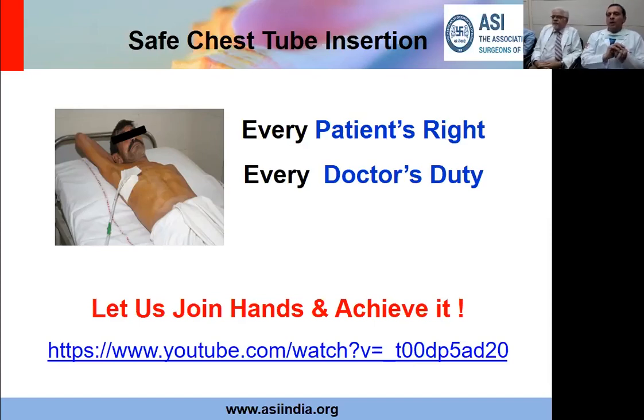So if there is no hemothorax, there is no pneumothorax, and the patient is just to be put on a ventilator because of, say, head injury, and the patient has no problem at all, I don't put prophylactic chest tubes in that situation. However, there could be a situation where you have associated multiple rib fractures and maybe a minimal hemothorax. Exactly. That's the situation. So that is a situation where, if the patient is being put on positive pressure ventilation, it may be safer to put a chest tube on the side of the multiple rib fractures.